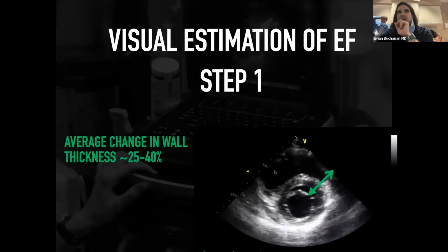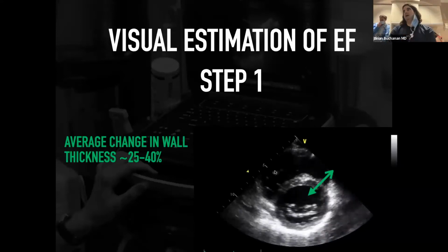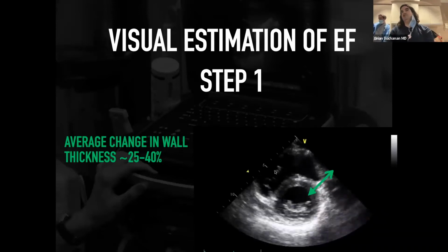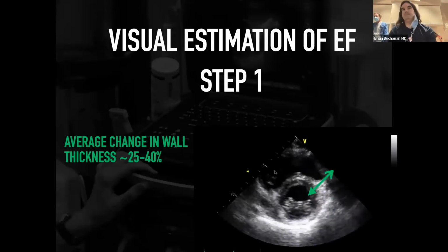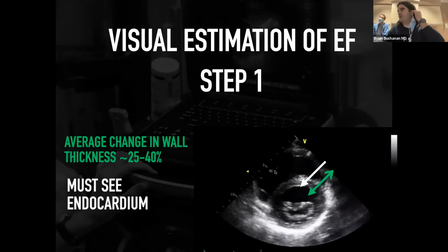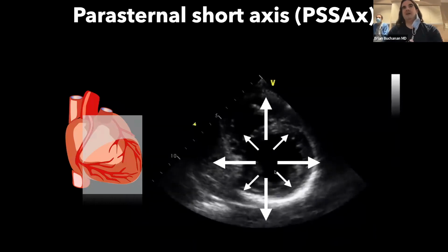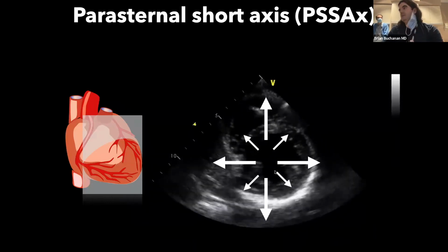We look at average changes in wall thickness. So if you're really intense, put M mode across there and compare how much the wall thickens. It should be 25 to 40% in terms of wall thickening. And obviously, to address wall thickening, you should really see the endocardium. Another example, each segment of the wall should thicken as well.